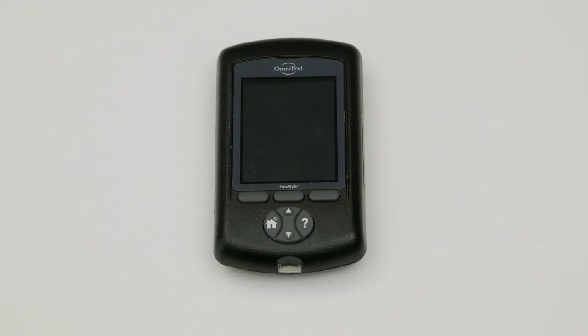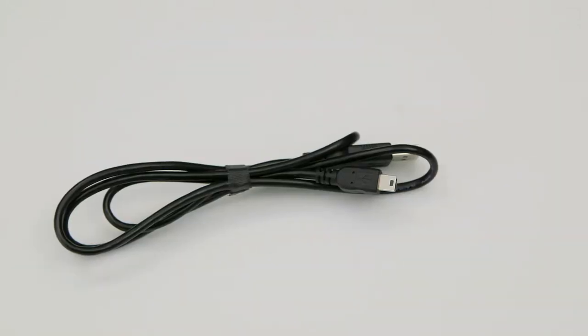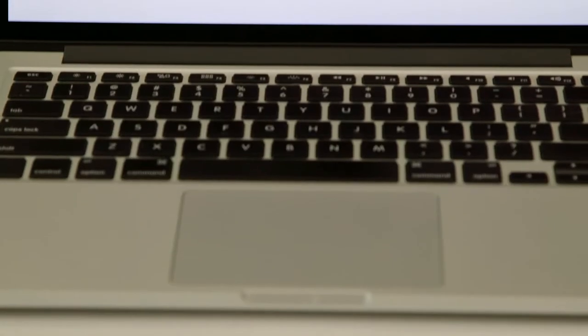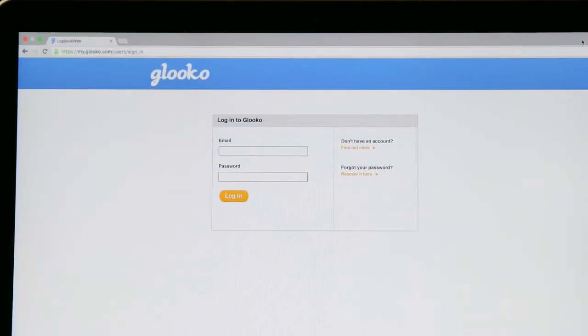For this tutorial, you'll need your Insulet Omnipod, a USB-A to USB mini cable, and a PC or Mac with a modern web browser.